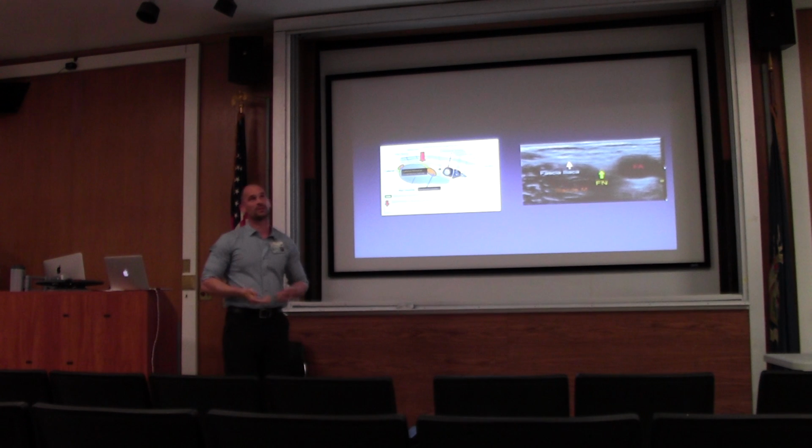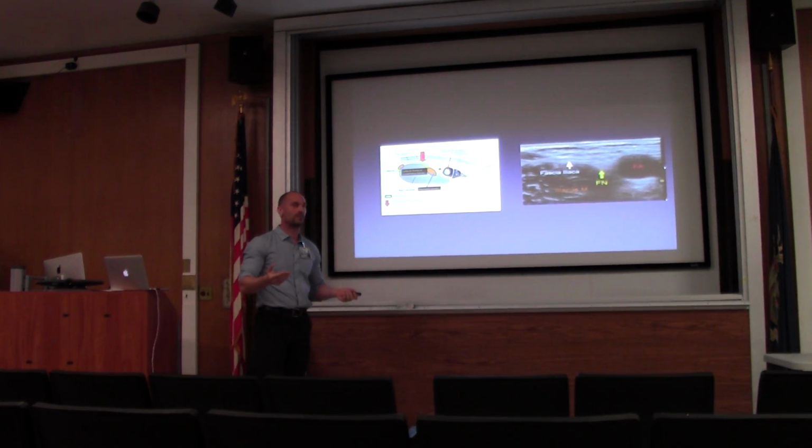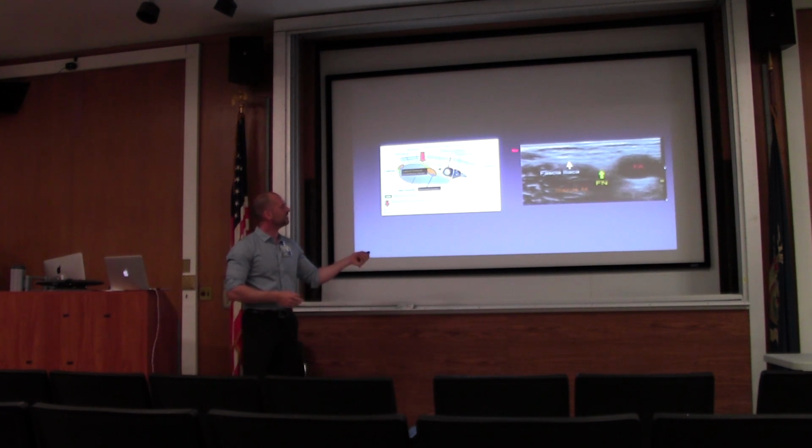There's an ultrasound, or at least there should be, in about every room in CCT, or excuse me, in the main ER, and in Downstate you should have other ultrasounds, so you should be able to do this by ultrasound. If you want to do a landmark technique, we can always go through that, but for first starting out, you should try it by ultrasound, and then if you feel a little bit confident, you can go the other way if you get a little bit better at it. But essentially, that's what we're looking for, and this is where we're going to place the needle.